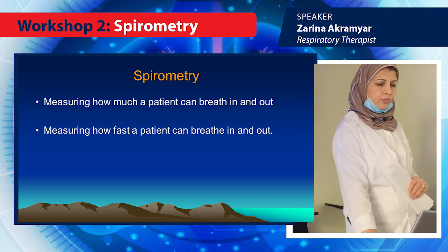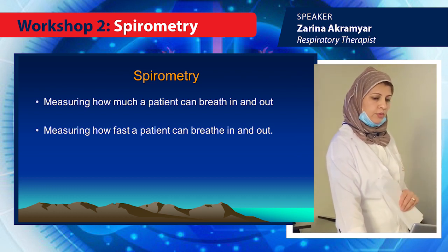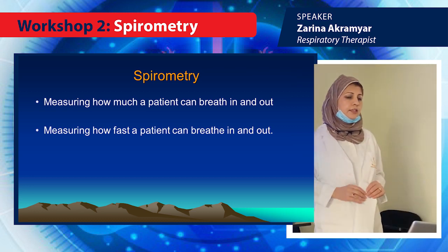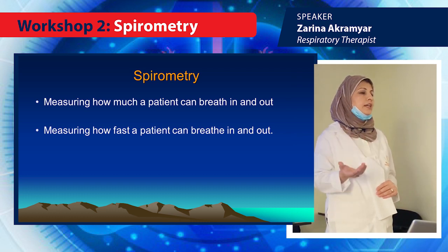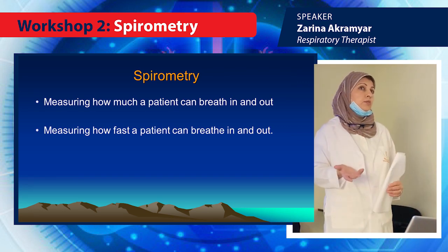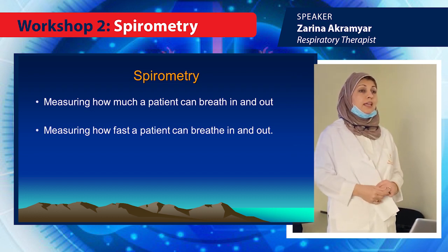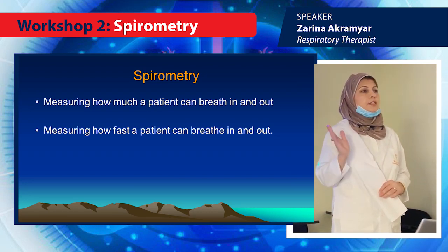Okay, so how much we can breathe in and out and how fast, that's why we are measuring. So spirometry, like I said, is an important diagnostic test that gives us a lot of answers to a lot of questions. For example, is there any pulmonary disease present? We don't know. Once the patient blows, we will see if it is present or not. Yes, what type? Is it obstructive or restrictive? Okay, let's say obstructive.